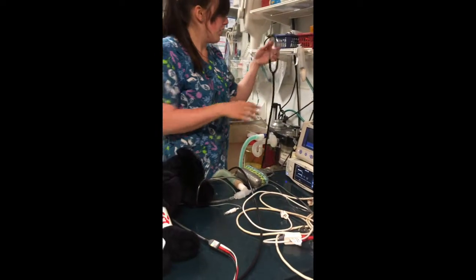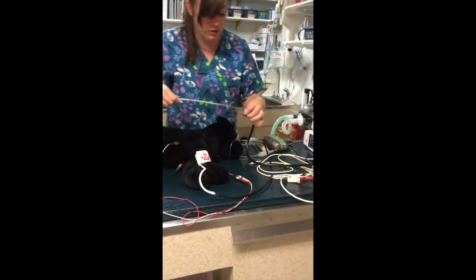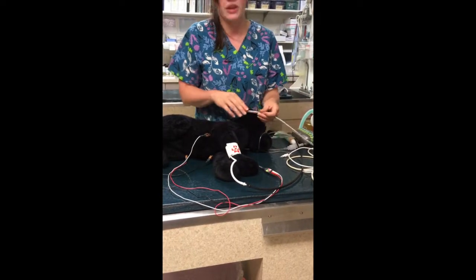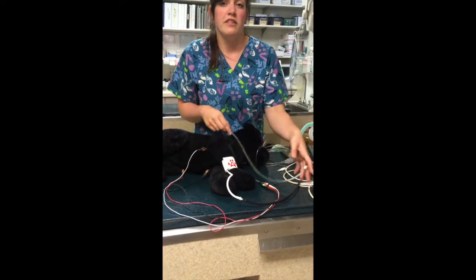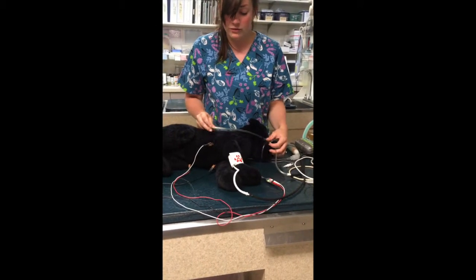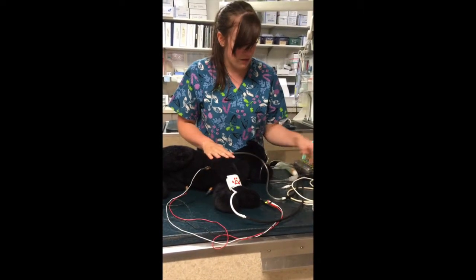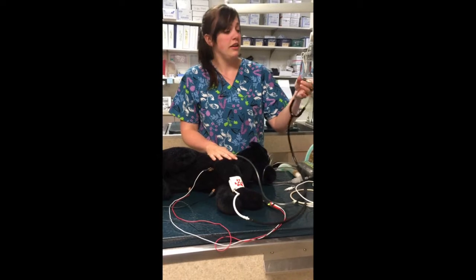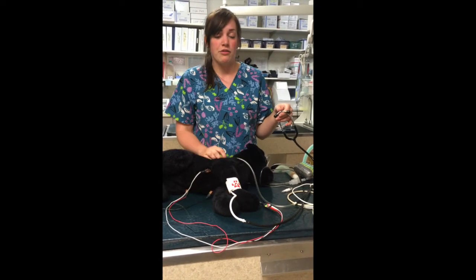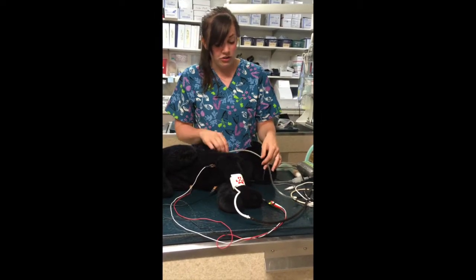Next, we have our esophageal stethoscope. So same idea for insertion. This goes inside the esophagus. When you are inserting this, you want to make sure you lubricate the end of this. You don't want to cause irritation. Insert this gently into the esophagus. You're going to be listening for the heart, so you want to go about mid-thorax. And once that is inserted, you can listen, and it's a good monitoring equipment for when you're having trouble listening with your regular stethoscope, or your ECG leads are just not working for you.